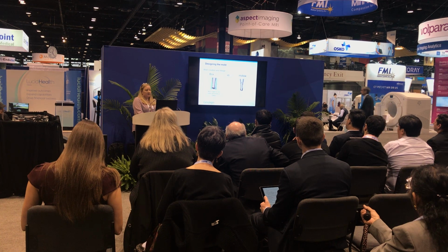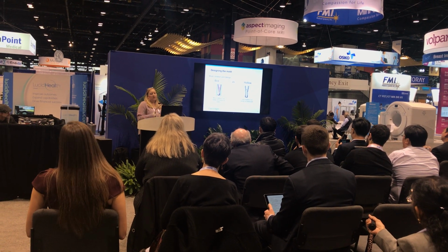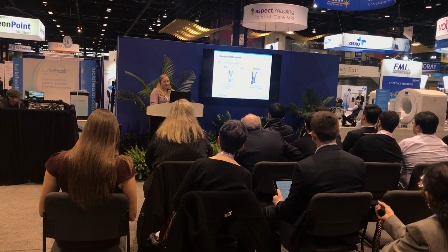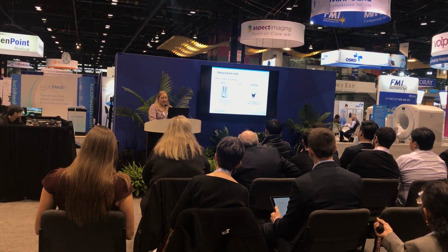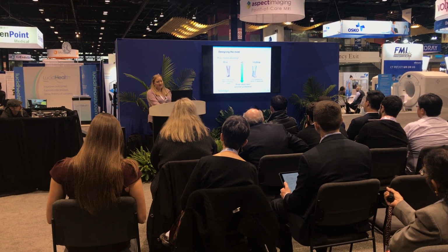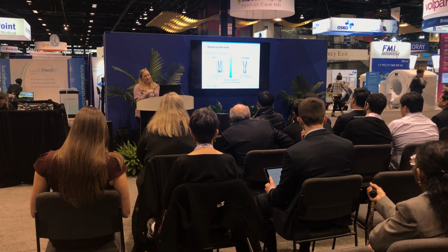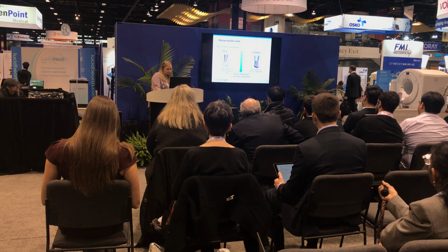But if you're looking into using less material, we've done this hollow method as well. You literally hollow the outside of your part and then subtract that part from it, so you have a nice little shell. And this is just us splitting it up and adding the fill holes, the exhaust holes, all that. Honestly, it's model dependent and user preference, so we use both for different reasons. On this leg, it's probably a lot easier to use the box since it's a weird bottom to it, but either way works for us.